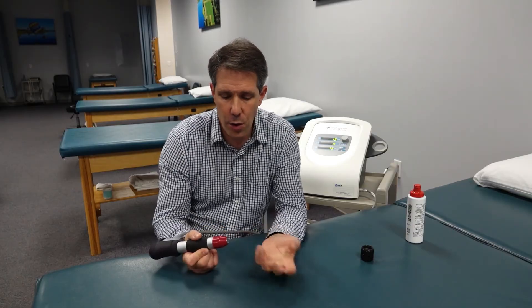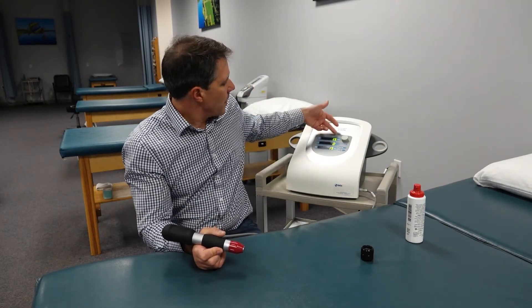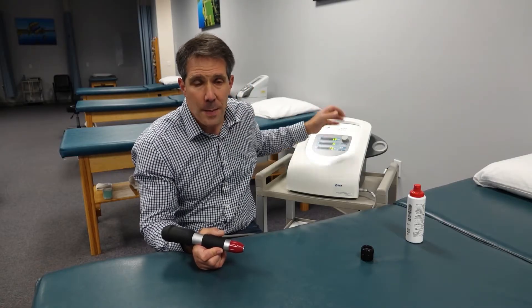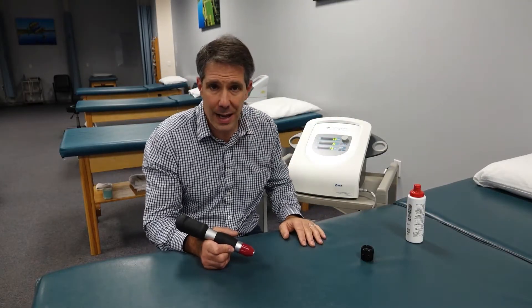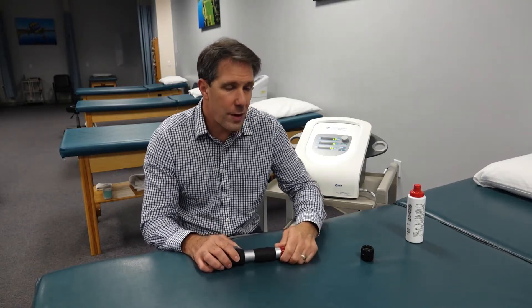There are not a lot of contraindications or precautions with this. People who have acute discomfort may have a little more discomfort when using it, so we might decrease the intensity — this is measured in bars and is very easy to adjust. It delivers 2,000 pulses over the course of about two to two-and-a-half minutes, and you can change the amount of pulses they're getting in regards to hertz. The protocols are all written out for the different diagnoses and are pretty simple to use.